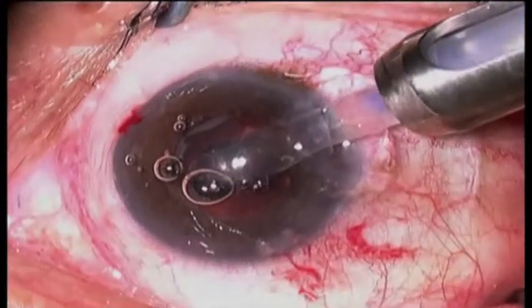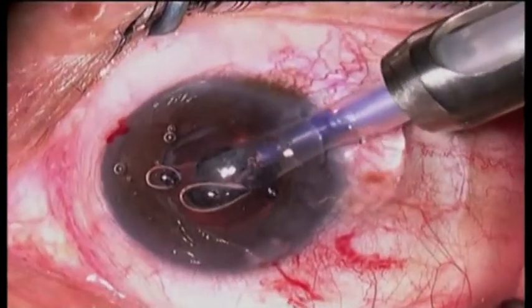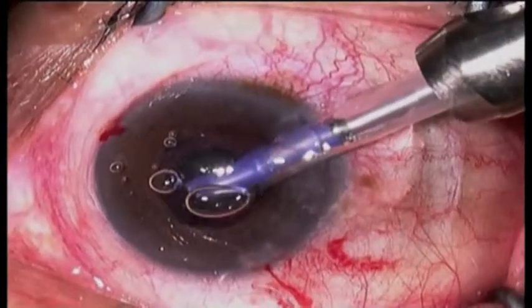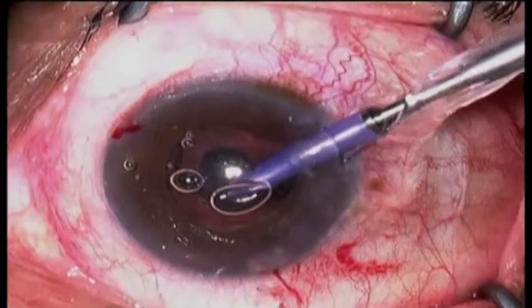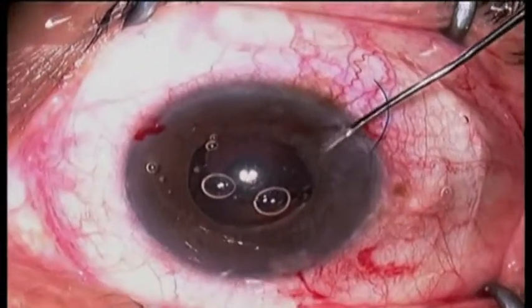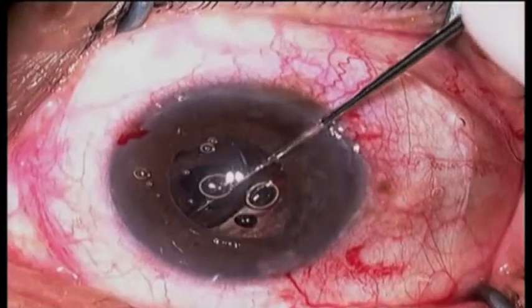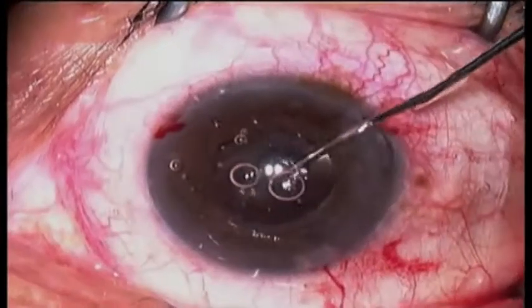Now we're able to put the implant — a Tecnis three-piece silicone lens — in the ciliary sulcus. I felt that this would be less likely to cause iris chafing and pigment dispersion than the acrylic implant that had been in there previously. Also, we had placed a monofocal implant in the other eye, and the patient expressed a preference for the monofocal implant over the multifocal.